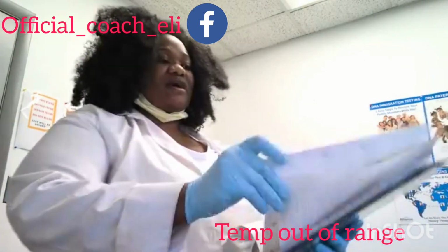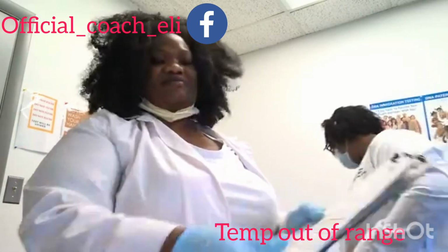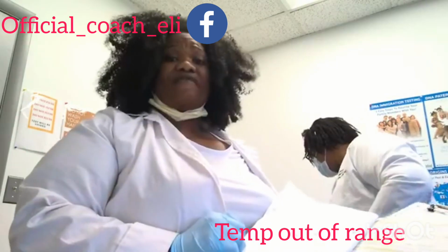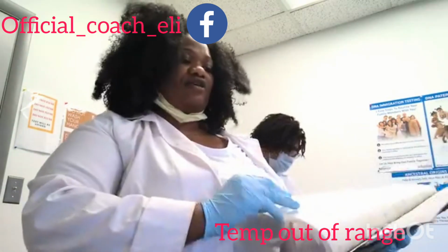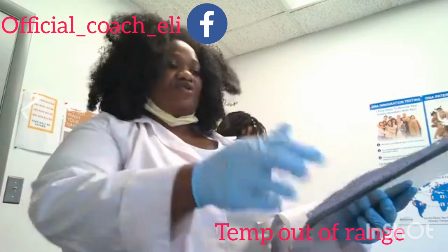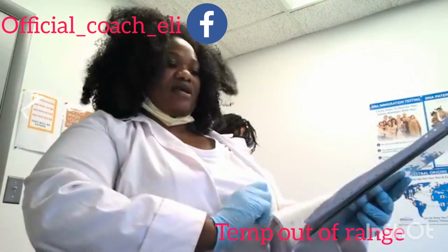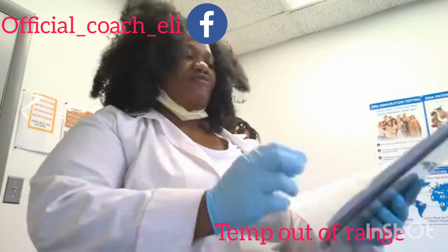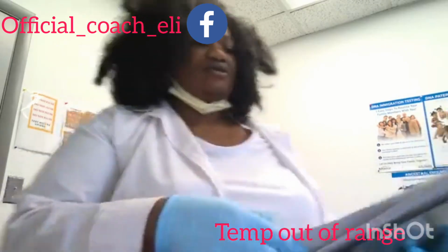So the rest of the copies, you would have to fax the MRO copy to the MRO. The fax number is right there. You have the MRO. That's your MRO. So you should have their fax number. Then you're gonna go ahead and give the collector, you keep 1 for yourself. The 4th copy is for the employer. All right. You're gonna fax that to the DER, and you're gonna go ahead and give the donor a copy.